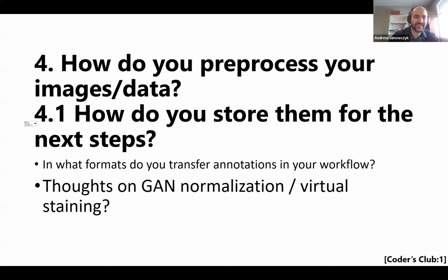Yeah. Okay. Maybe I just haven't seen the evidence, but if you are, for example, concerned about lossy conversion of data from your original scan to JPEG, there's no justification, in my opinion, for using GANs, which introduce all kinds of unknown and very difficult to understand artifacts into your training set.